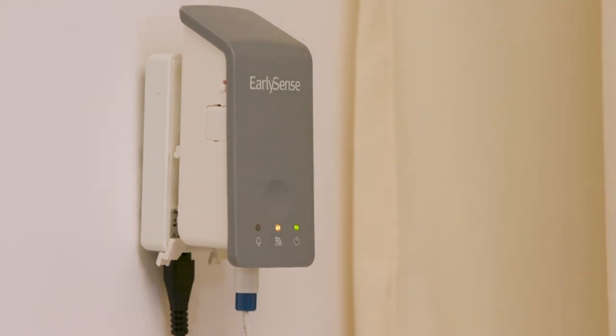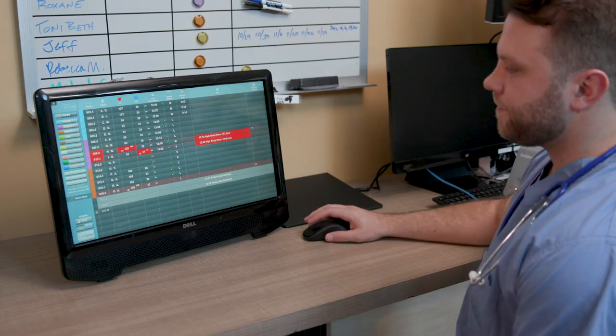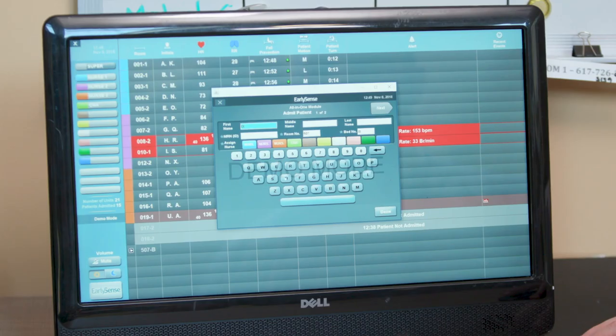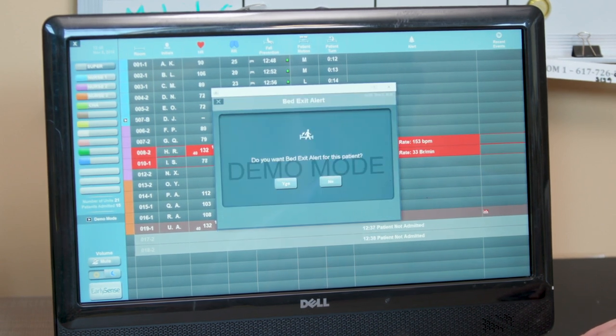The network LED will show a yellow light when connected to the central display station. A patient is admitted on the central display station by selecting the row with the patient's room and bed. To admit a patient, simply enter the patient information on the Admit Patient screen. ID, room number, bed number, and assigned nurse must be entered for the patient to be admitted.